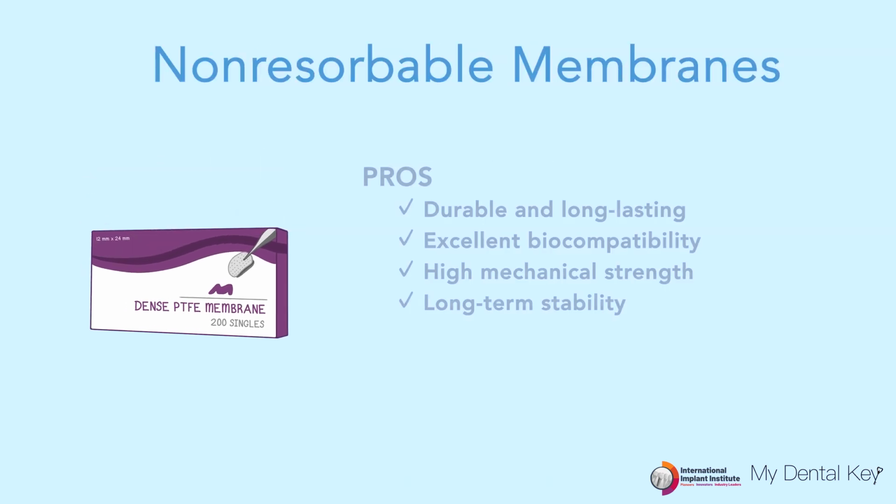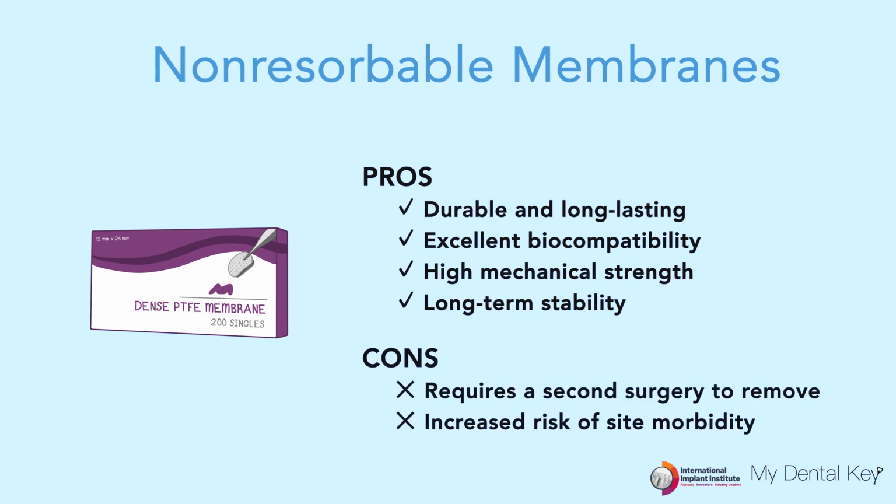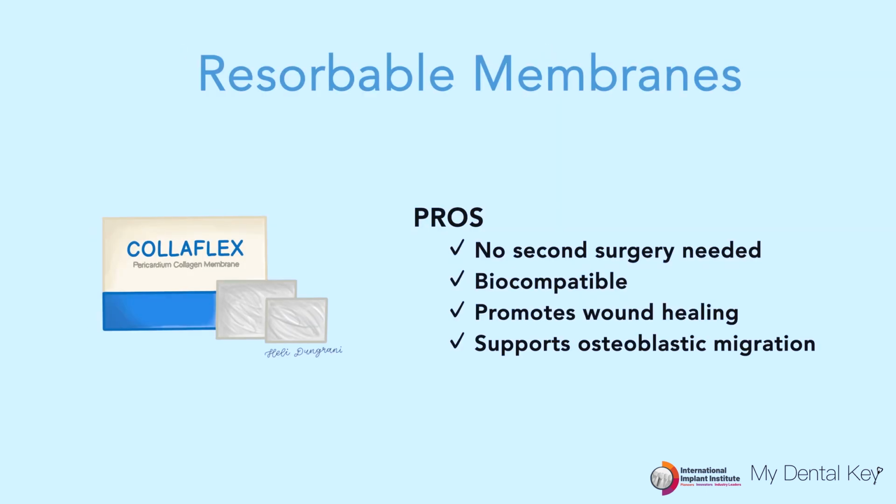Non-resorbable membranes like PTFE are durable and have excellent biocompatibility and mechanical strength, making them ideal for long-term stability. However, they do require a second surgery to remove, which can increase the risk of site morbidity. Resorbable membranes don't require a second removal surgery as they are enzymatically degraded.